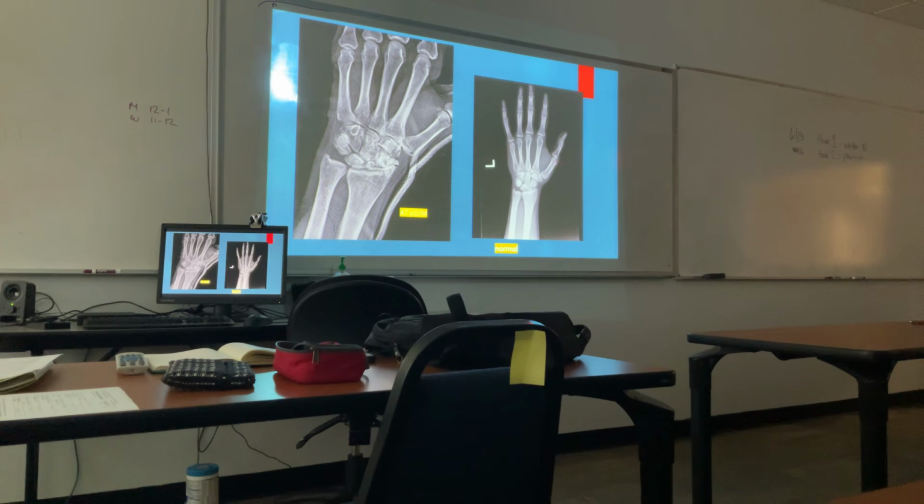Where's the difference, the fracture? No, this is the abnormal, this is the normal. It looks like the scaffold. Scaphoid, okay, there's a normal one, this doesn't look the same, okay? Smashed. All right, so the idea is you re-x-ray, you want to see if this is progressing, as Haley pointed out.